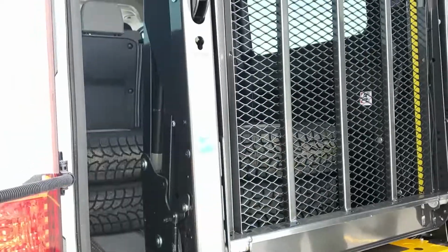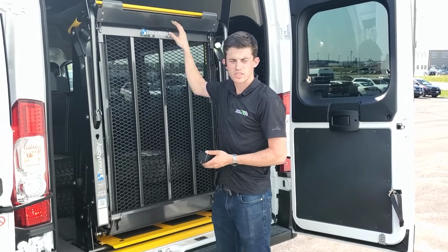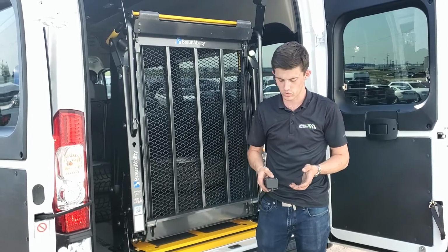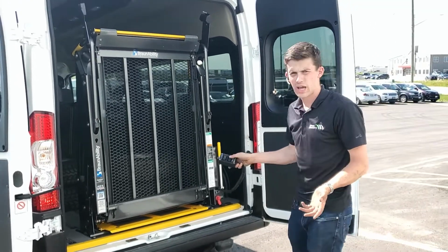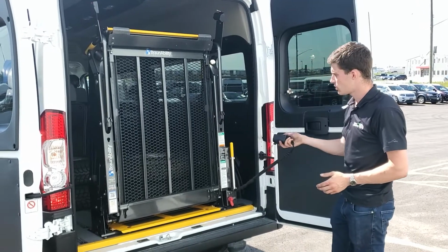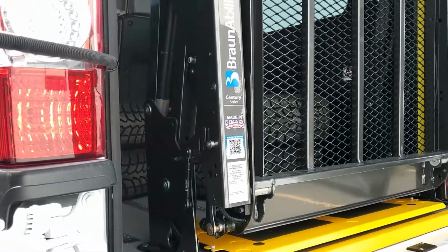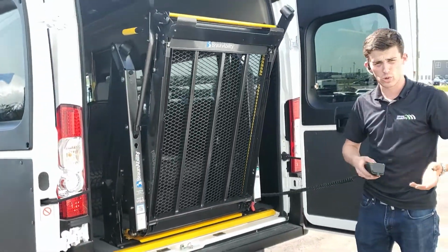Unfortunately, that is not correct, and it can cause damage to the lift because you can see the lift is now very loose, and it will rattle and could damage other components on the lift. Now, as you can see, it's caught on the hooks. I press unfold, and nothing happens to the lift. The simple fix is to press fold. As you can see, the lift moves back into the vehicle. It releases the catches as we saw earlier, and you can release the lift and use the lift and load your clients.